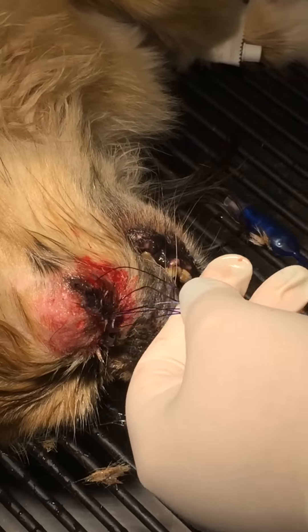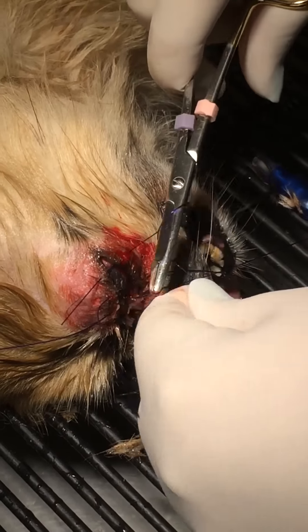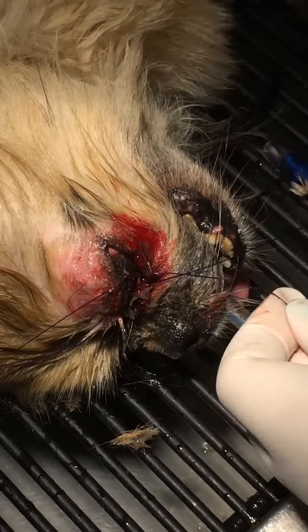Ta-da, they're amazing, and then you just suture these closed. So is that what the button — the whole button process? Yep, four. Of course you don't do that — don't pull your suture all the way out.